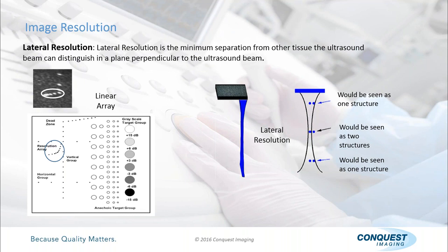So in this case, if this was a 1.5 megahertz probe, we would not expect good lateral resolution. But you know, if we're using a higher frequency, that should improve.